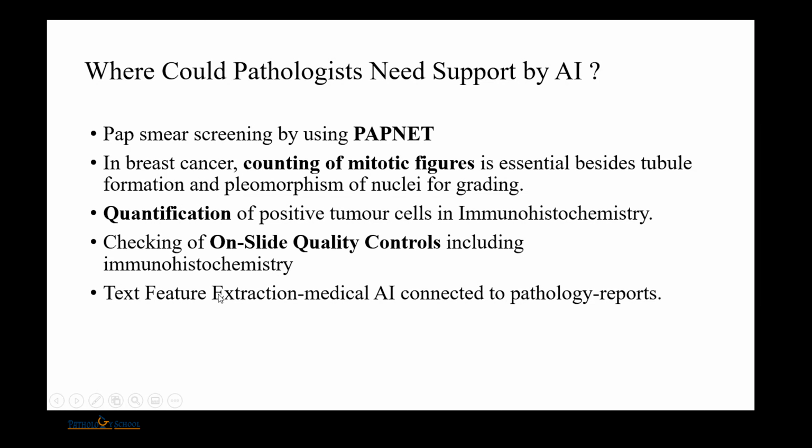Now, feature extraction is a new terminology, and it's a medical AI connected to pathology reports. Basically, you can give your diagnosis, and the text comes out according to the diagnosis that you give.